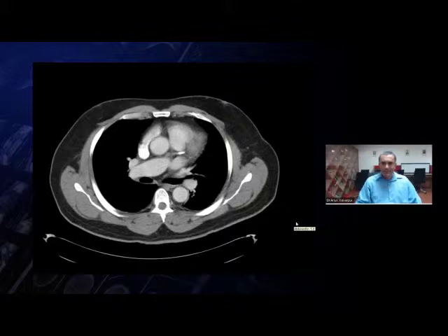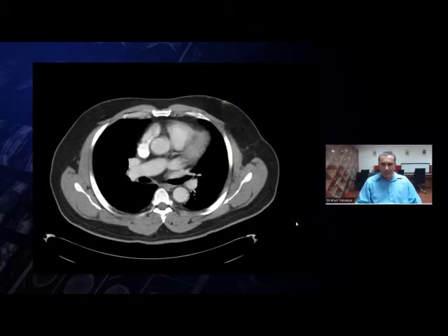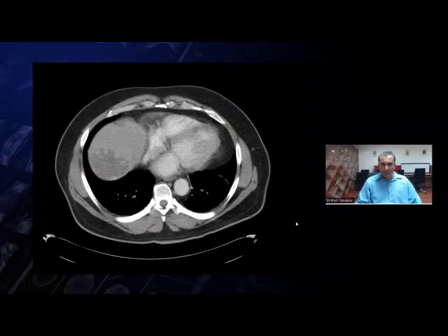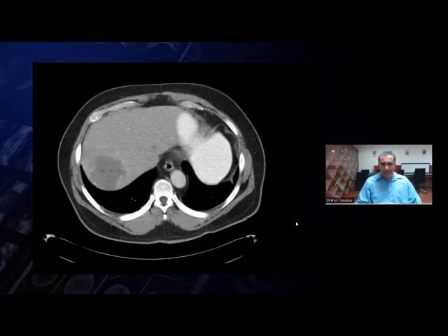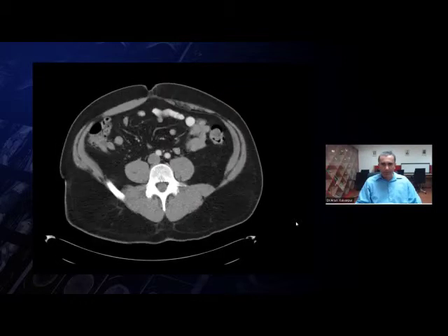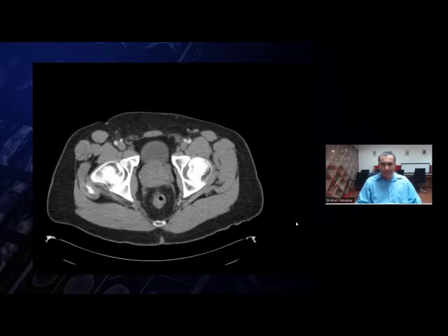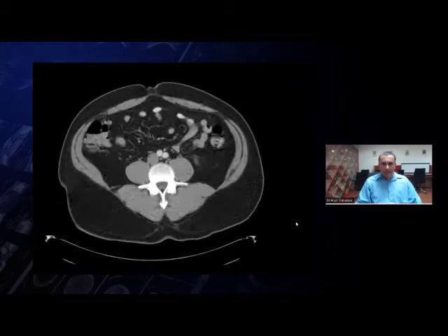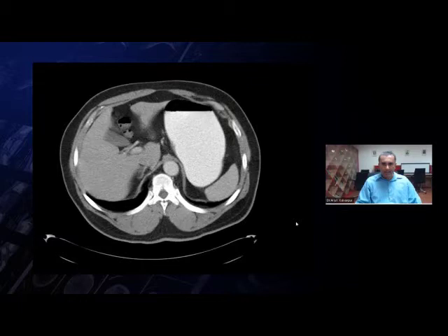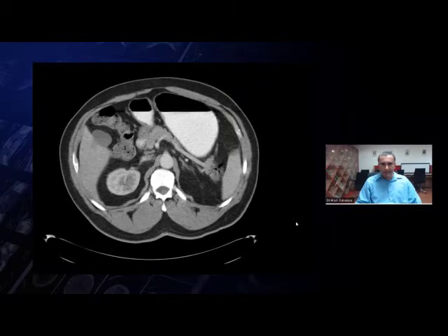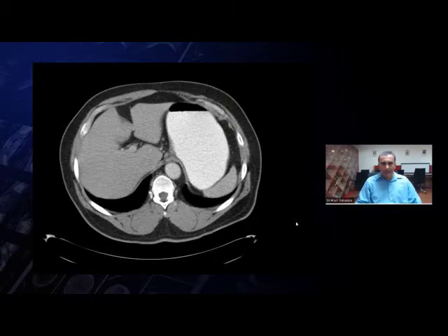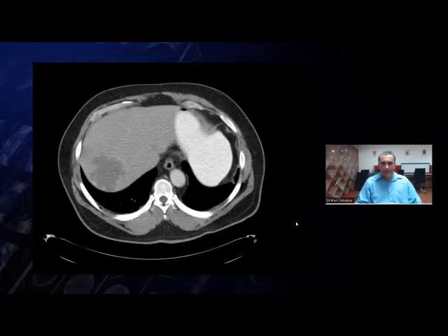Here is an interesting case from the emergency room, interesting for a variety of reasons. Let's look at it once very quickly and then discuss. We're scrolling from top to bottom — it's a CT scan of the abdomen and pelvis with oral and intravenous contrast. One of the reasons this case is interesting is because it tells you that the most obvious finding is not necessarily the one of significance.